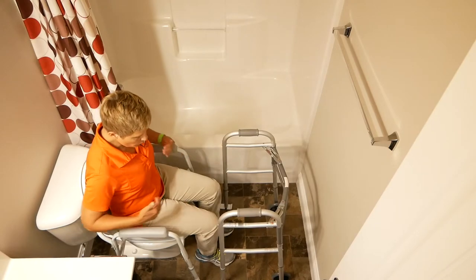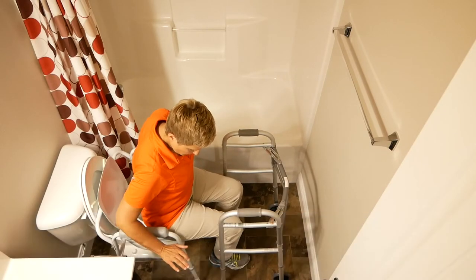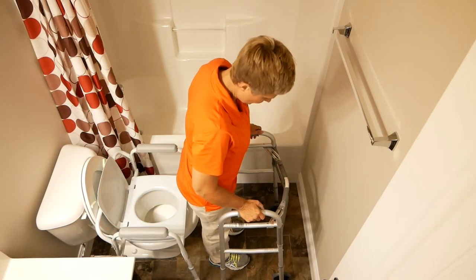Now when they go to get up, you're going to want to give them verbal cues to scoot forward so that we're getting our weight forward. We're going to push up with our hands, bringing our head and shoulders forward, coming up and grabbing the walker one hand at a time.